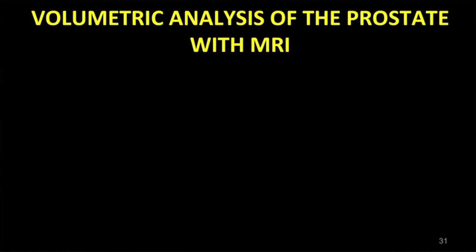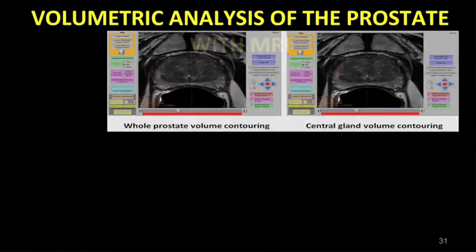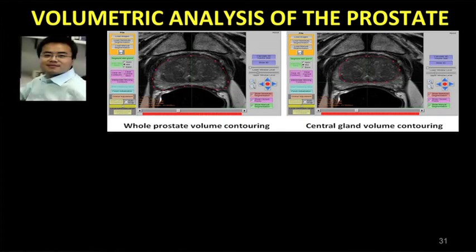While we are imaging patients for cancer, we also see quite a lot of patients with BPH. Benign prostatic hyperplasia is the number one prostate-related disease in men. It can be symptomatic or asymptomatic, but it's a problem for aging men. While working on that, our clinicians needed a reliable way of reporting the zonal volumes of these patients. For this purpose, we worked with Pinkun Yan from China. He provided us a semi-automated prostate segmentation tool, which gives us the zonal volumes of the prostate. We started using these volumes and segmentations for our volumetric registration for biopsies and for printing our molds.